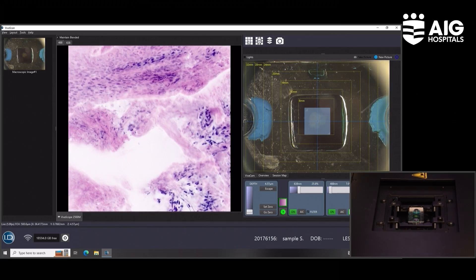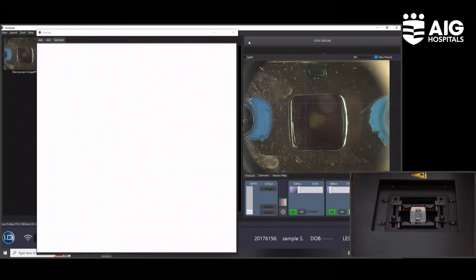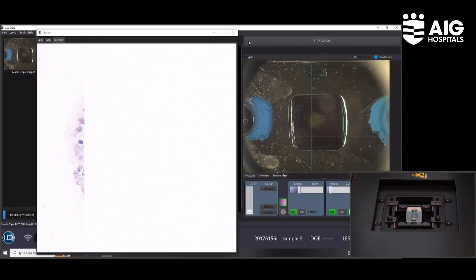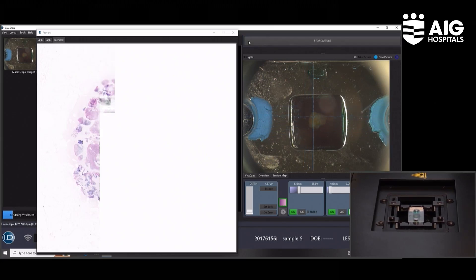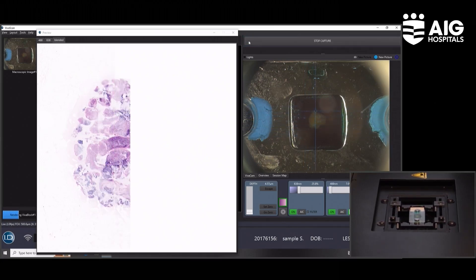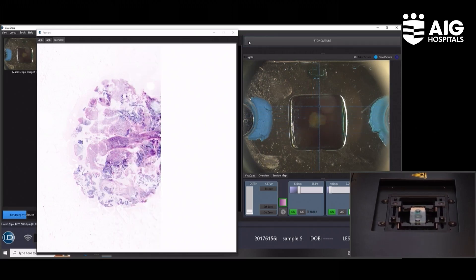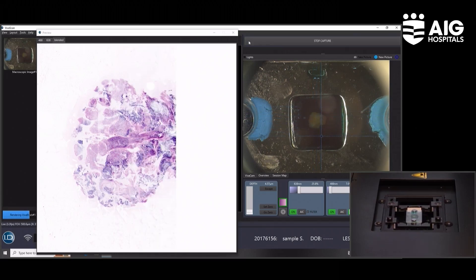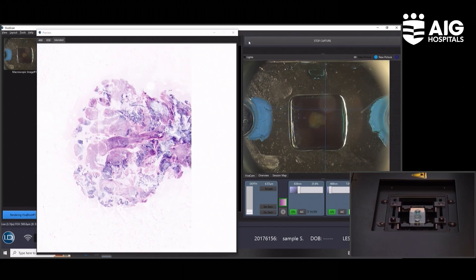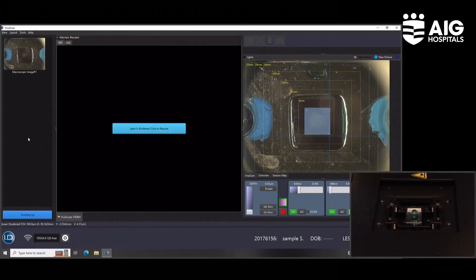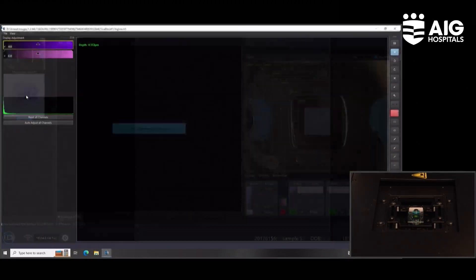I start scanning. As you can see, there are strips of the image which in the mosaic are stitching together. When we are finished, the image is ready for evaluation by our pathologist. So one or two more strips — it's done. Now it's stitching, and then I will open the image.